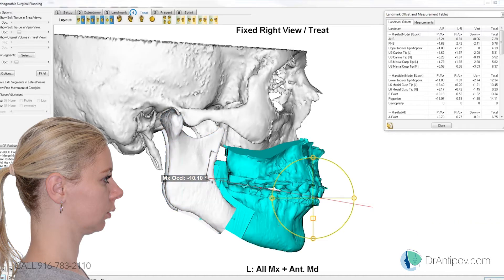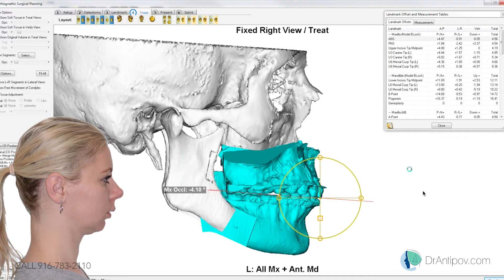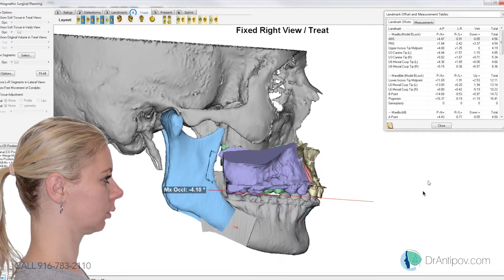How many degrees? The upper first molar should drop down about 6 millimeters on my 2D planning. Let's do a 6 degree change now and see what happens. Okay, so I went ahead and rotated it at 6 degrees — we're at a 4 degree occlusal plane now. Right now the right molar is dropping down about 6 and a half, and the left molar is close to its original position with the cant correction.